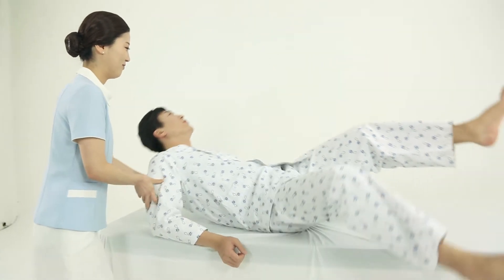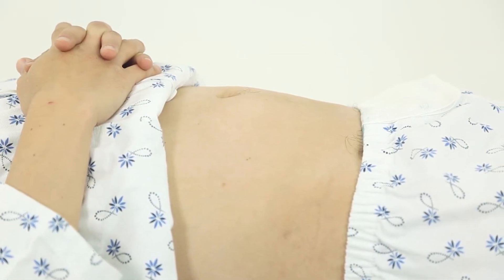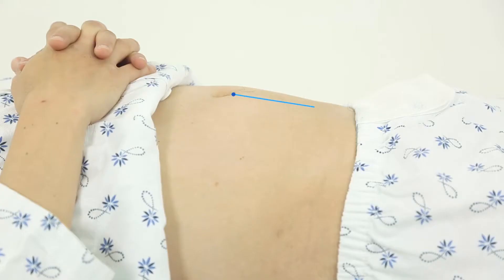Lift up the patient's garment exposing the abdominal region from the pubis to the navel. Apply an ample amount of gel to the probe head. Draw an imaginary line that extends from the navel to the pubic bone and place the probe on the patient's abdomen 3 to 5 centimeters above the top of the pubic bone.